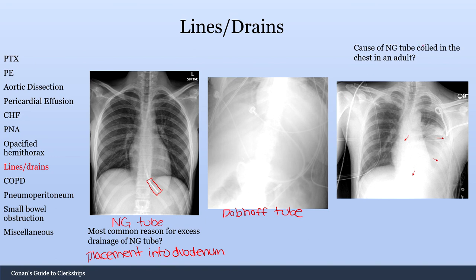What is the cause of an NG tube coiled in the chest in an adult? Here you can see the NG tube coming down and then back up — you know it's not in the lungs because it's not tracking down the main stem bronchi. This would indicate a ruptured diaphragm, which causes the stomach to herniate up into the lung field. The NG tube is still in the stomach, but you're seeing it in the lung field because the diaphragm is ruptured and the stomach is displaced superiorly.